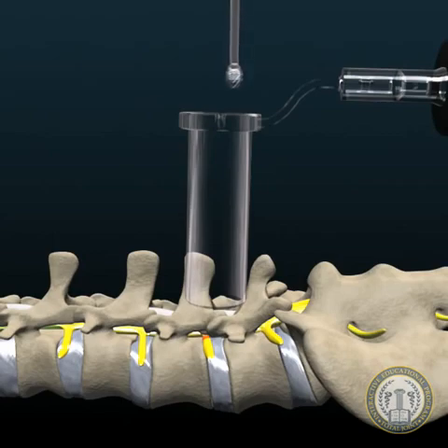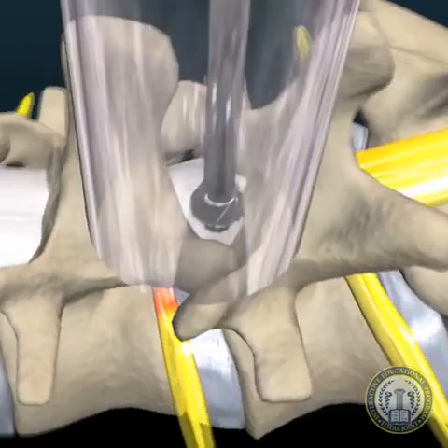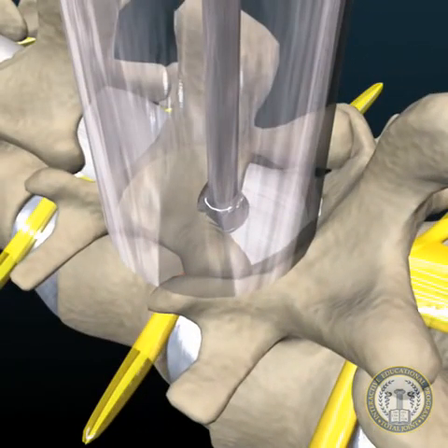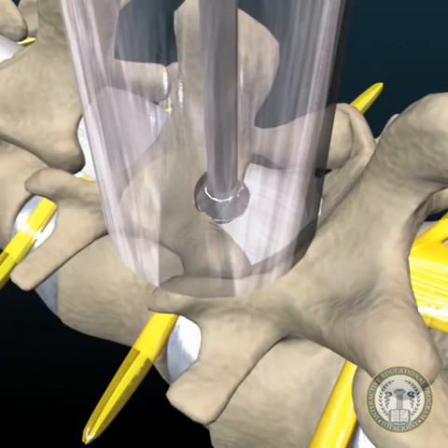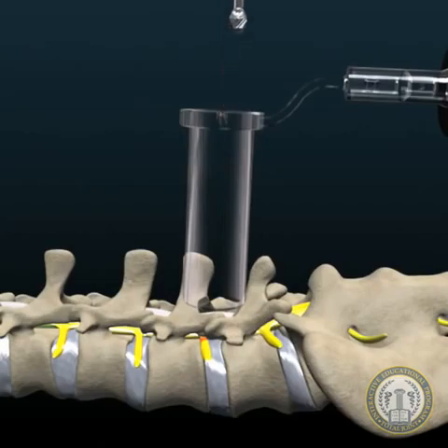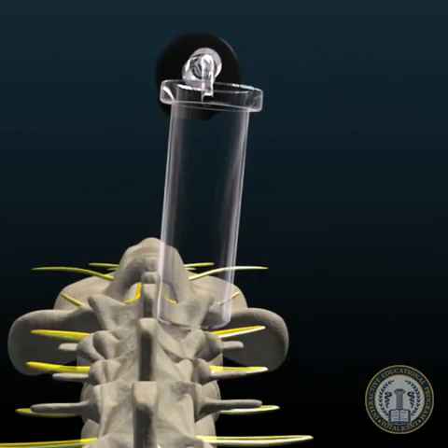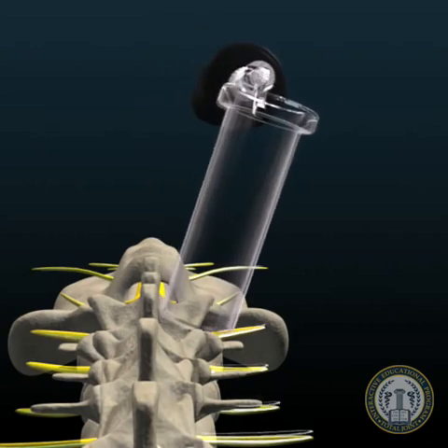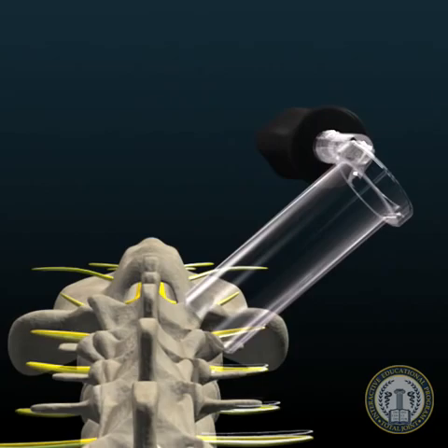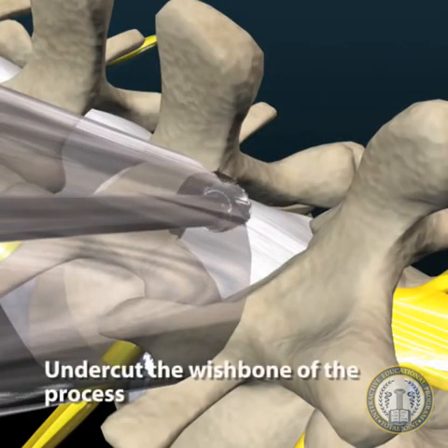A hemilaminectomy and medial facetectomy are performed using a high-speed drill and Kerrison rongeurs, once again taking care to avoid stripping the facet capsule or removing excessive amounts of the facet. The ligamentum flavum is left in place at this point, and the tube is then angled steeply toward the contralateral side. The undersurface of the spinous process is drilled away.